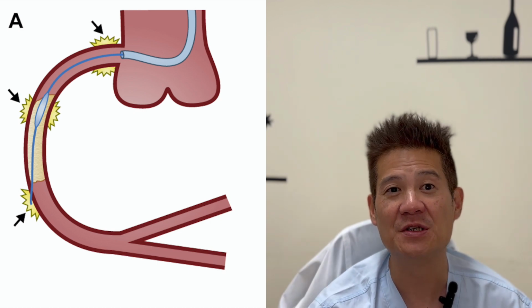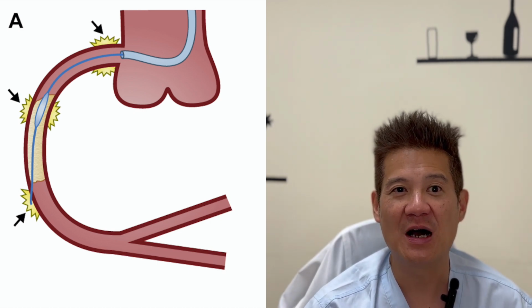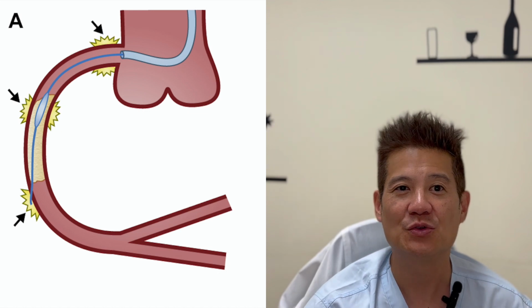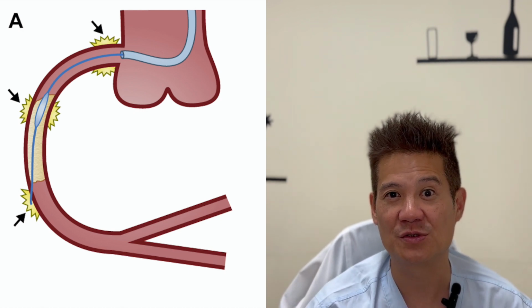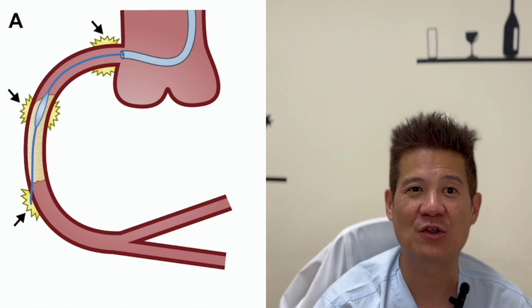The third, of course, is that balloons can do this. When we're doing reverse CART, we use a big balloon that cracks the proximal plaque, and that can produce cracks that go into the subintimal space. So often when people do reverse CART, they remove the antegrade syringe so that we don't do any more injections, so that we don't pressurize the antegrade true lumen, causing extraplaque hematoma.